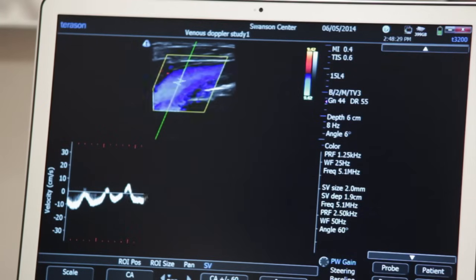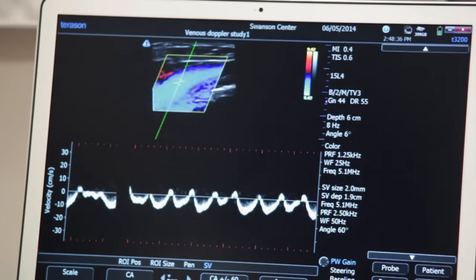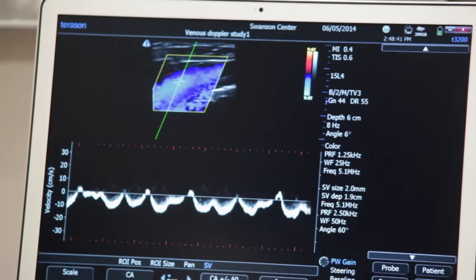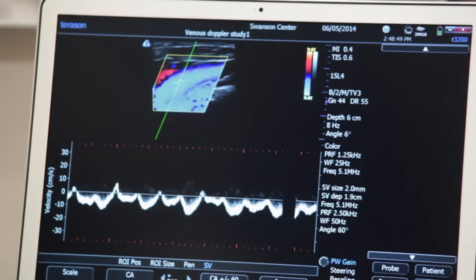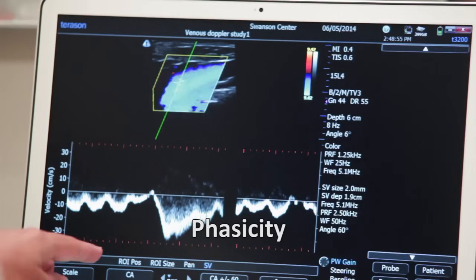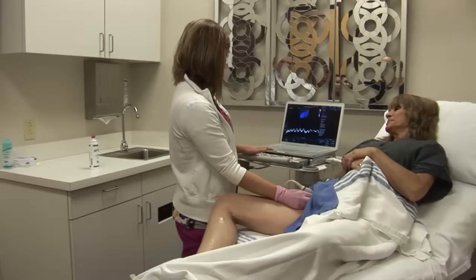And then lastly we like to show the phasicity of the venous blood flow with respiration. This makes sure that there is not any thrombus in the iliac vein or proximal to this section we're in now. Have you take a deep breath in for me — it slows the blood flow down — and breathe out, and it comes back. And that would conclude our doppler study.